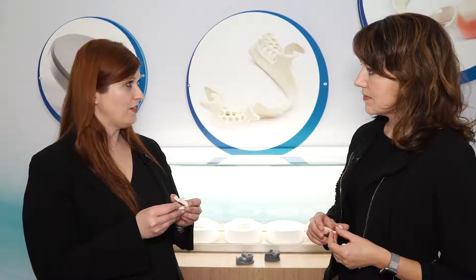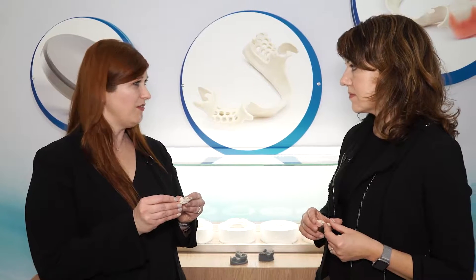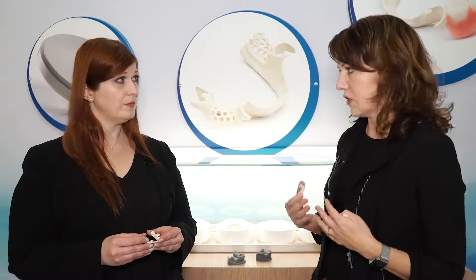One property that most prosthodontists look for in their removable partial dentures is a material that's relatively rigid. I can see here that this material doesn't really flex very much. It doesn't, but we actually believe it flexes just the right amount. Solvay has, in their high-performance polymer portfolio, 35 different chemistries. When we came into this space, we looked at the requirements for the market — what metal was doing well, and what it wasn't doing so well. We believe that these properties will work in concert with the patient's mouth instead of trying to take over for it.